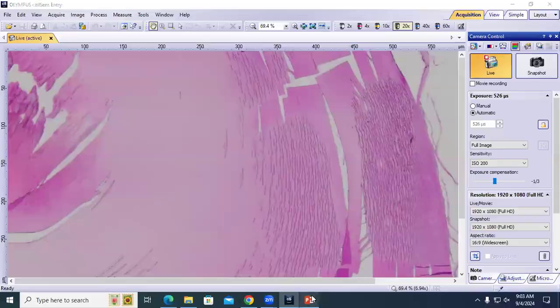In some cases where we have breaks and separation in Descemet's membrane, we've seen glaucoma without any other more obvious secondary lesions. And we believe that if you have a large enough fragment of Descemet's membrane floating about, it could work as a valve and block the pupillary margin and cause glaucoma. So many ways to go about this, but the main things are there.